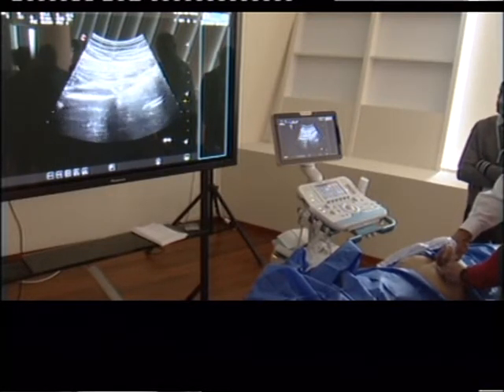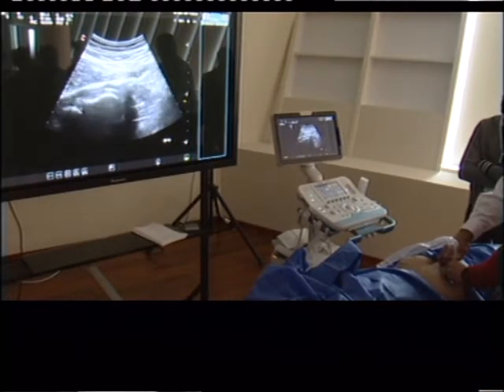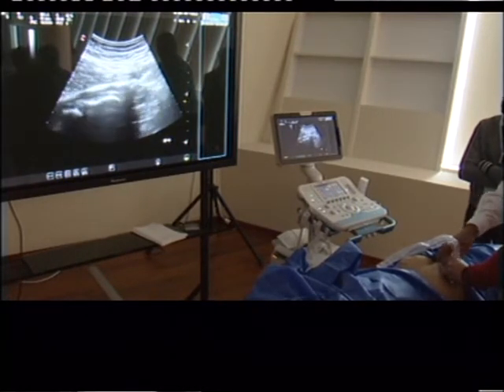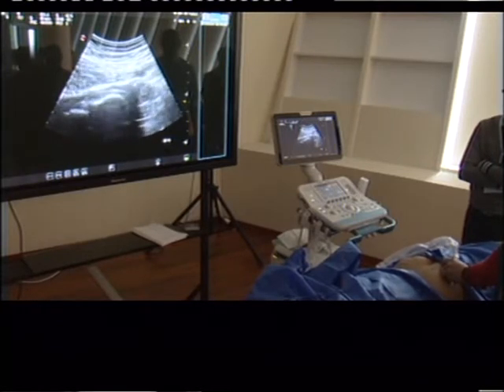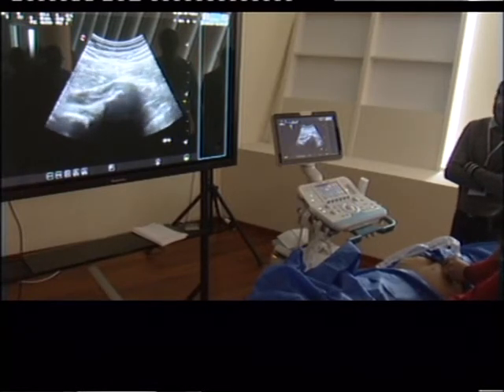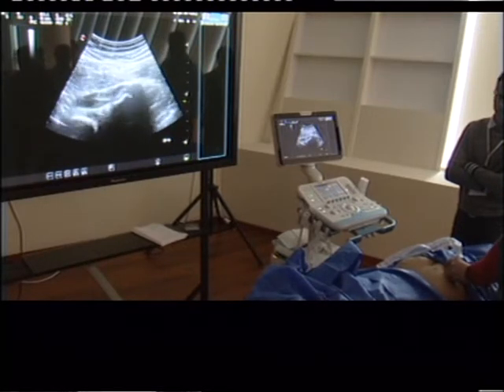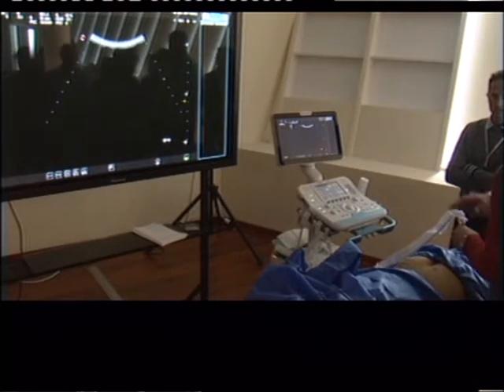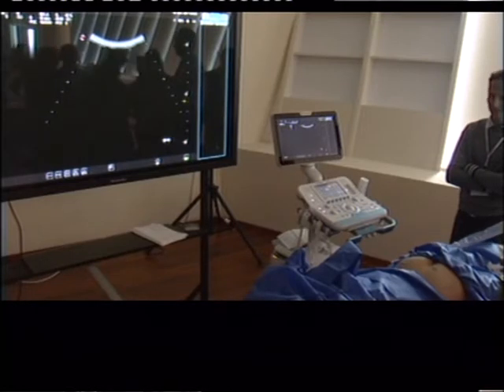Sacrum, sacral spinous, sacral tuberous, pudendal nerve and artery. Then down, the sciatic nerve now shows up, obturator internus, waterfall, and then go down just a little bit more, and hamstring, conjoint tendon, right there, quadratus femoris. Just a tiny bit. My patients usually have a big fat ass, and that's why we use the big fat ass probe.